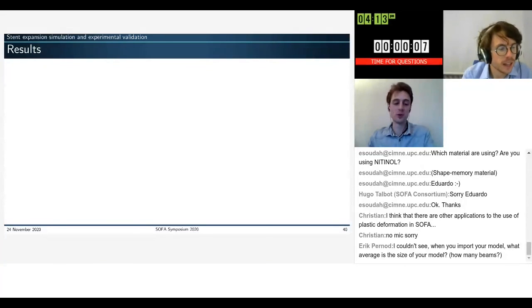Okay. Thank you, everyone. Eric asked, I couldn't see, when you import your model, what is the average size of your model? How many elements? Very quickly, it's around a few thousands of elements. For the smallest beams, it's around 1,000, and for the longest, we had around 3,000 beam elements.